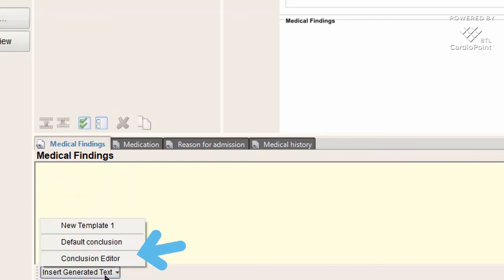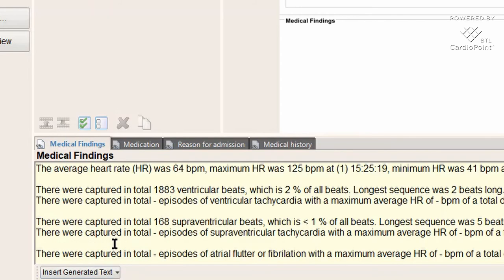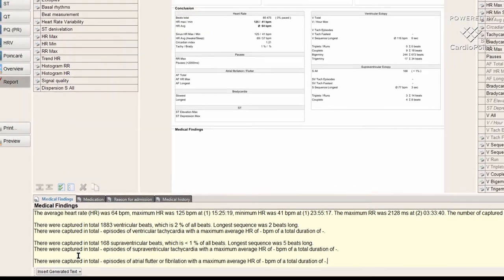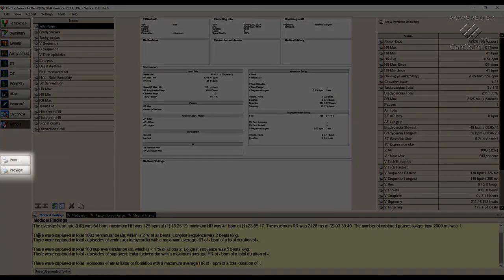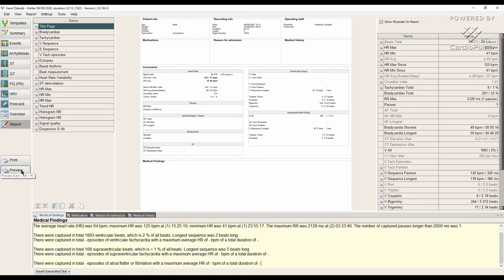The tool automatically writes all the key values from the examination into medical findings. Once we are satisfied with the report layout, it is possible to see the preview and then print it or save it as a PDF.